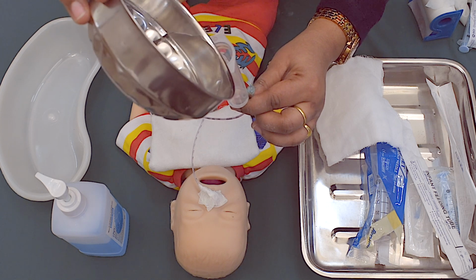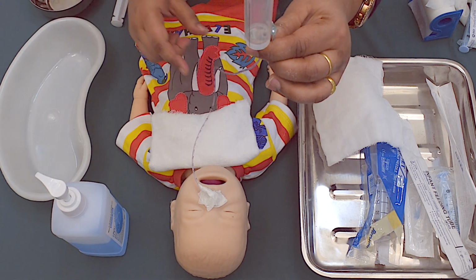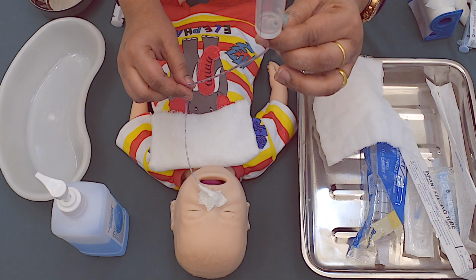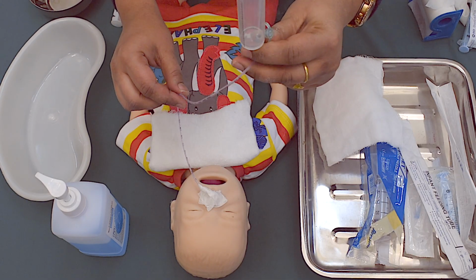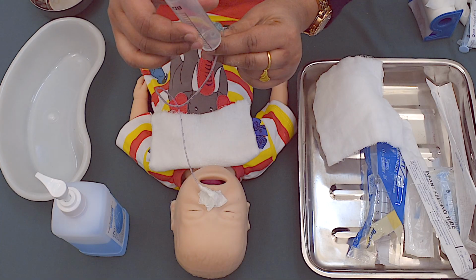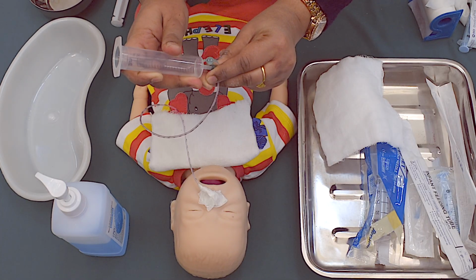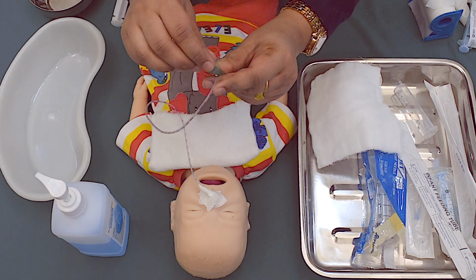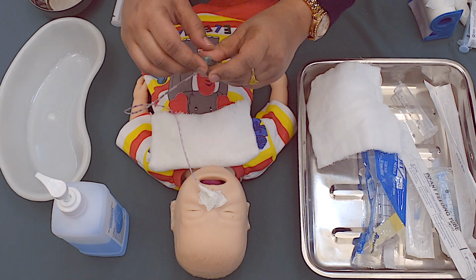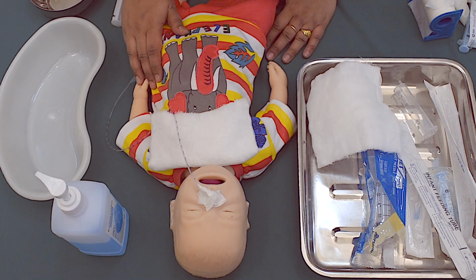Flush the tube with water. Do not push in air. Clamp the tube again and remove the barrel of the syringe. Close the tube and make the baby comfortable.